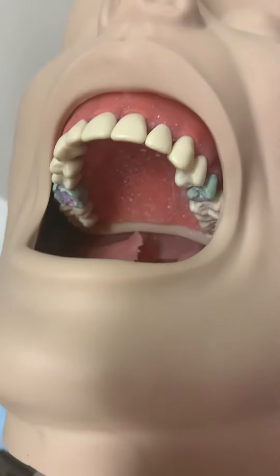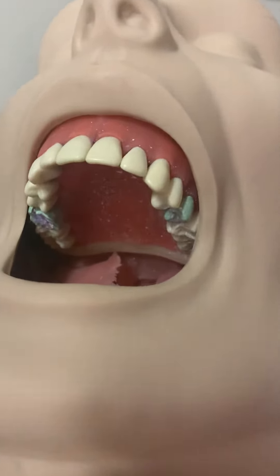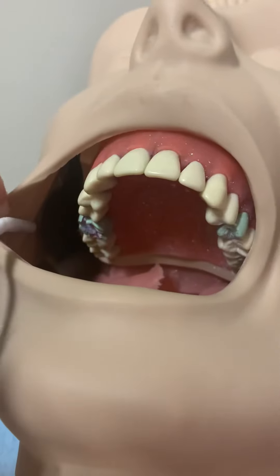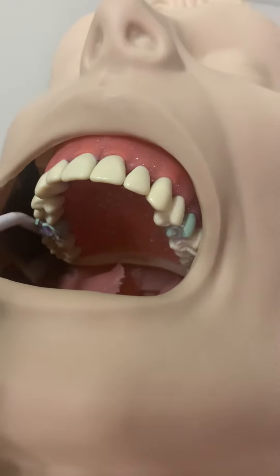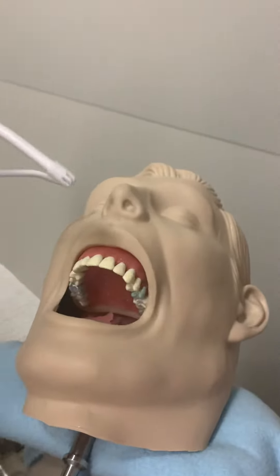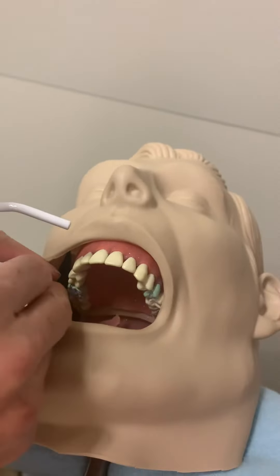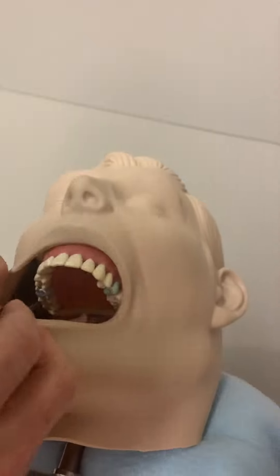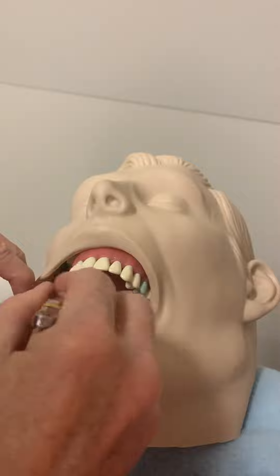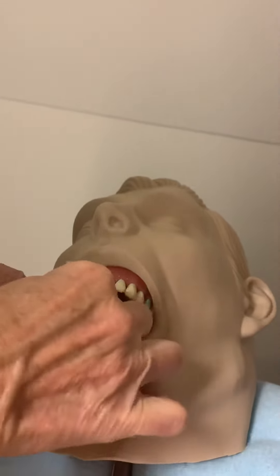So when the filling is all done, we're going to come in and we're just going to gently moisten the area behind the dry aid just a little bit, and the cotton roll. Then kind of hold this here, and then we're going to go right in and gather our aids here. They just disappeared — I can't even find them.